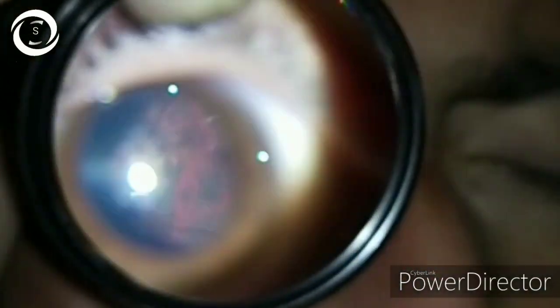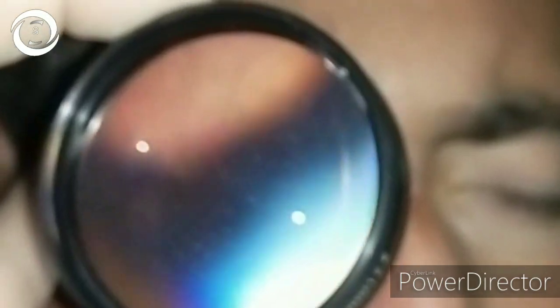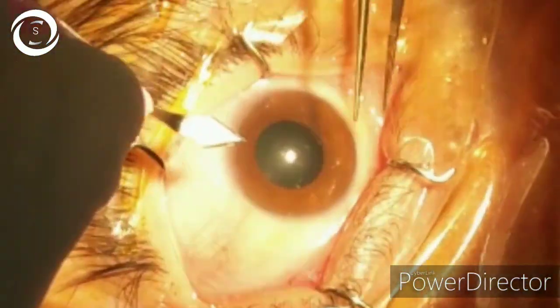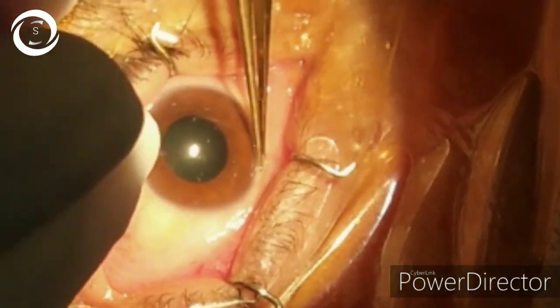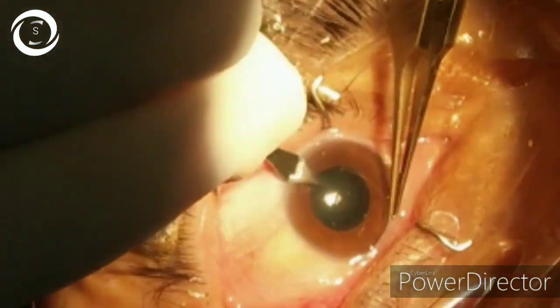We have done biometry of the right eye and its IOL number was plus 8 diopter sphere. Always do the surgery under topical anesthesia because the axial length is elongated. So under topical anesthesia, I am doing main port construction with a 2.8 phaco knife.